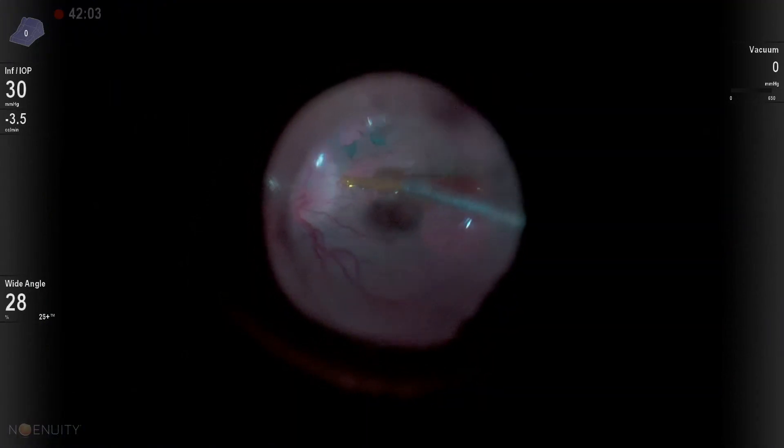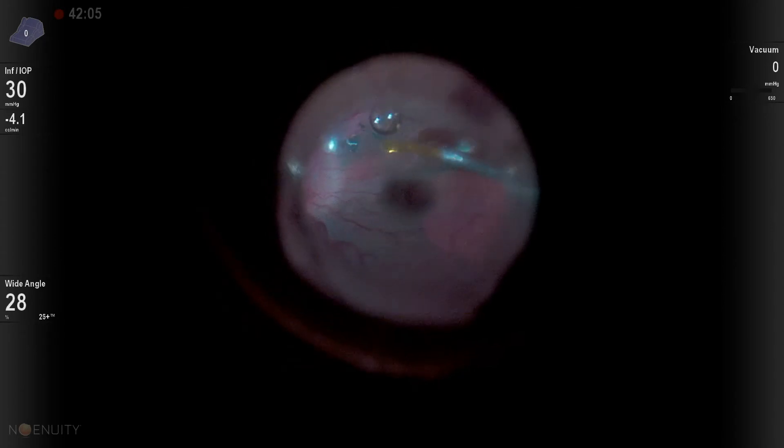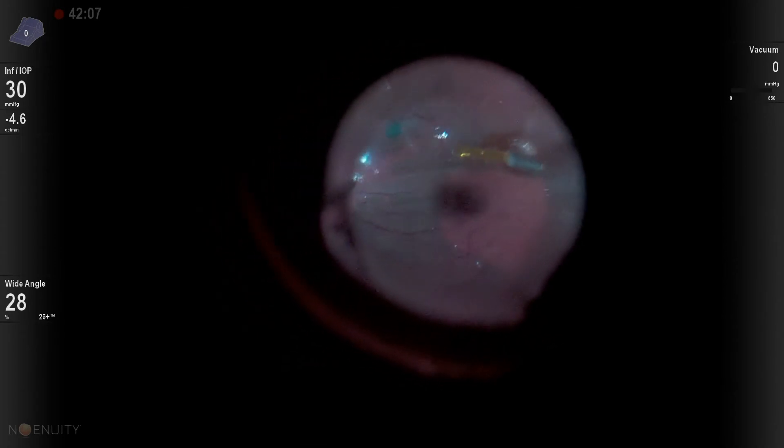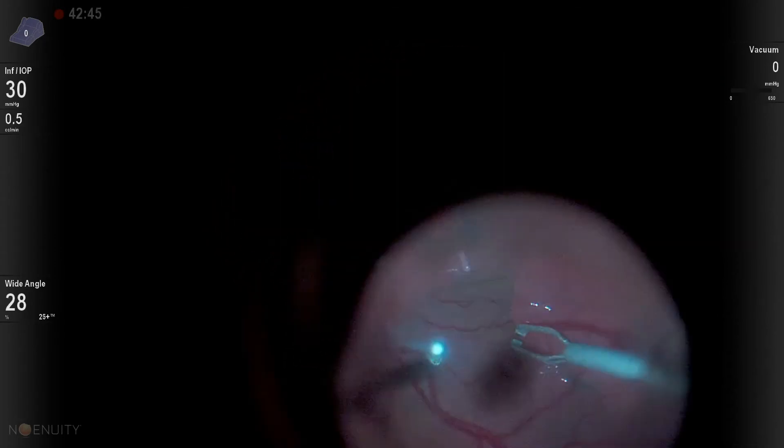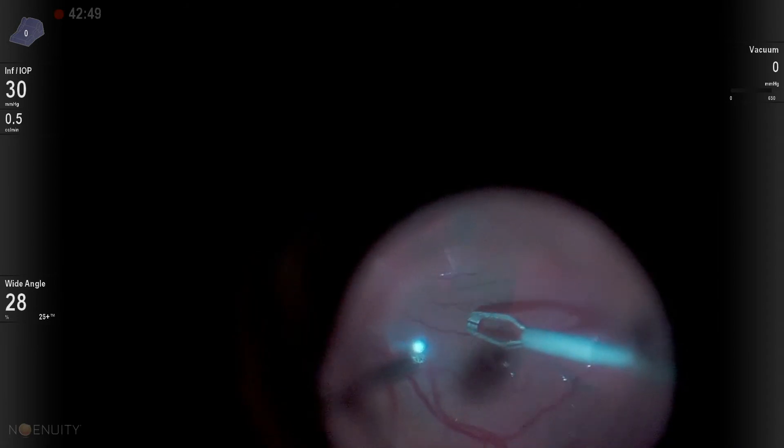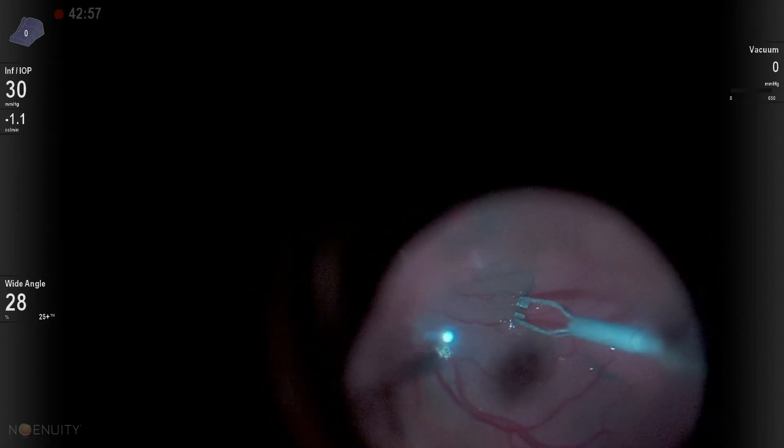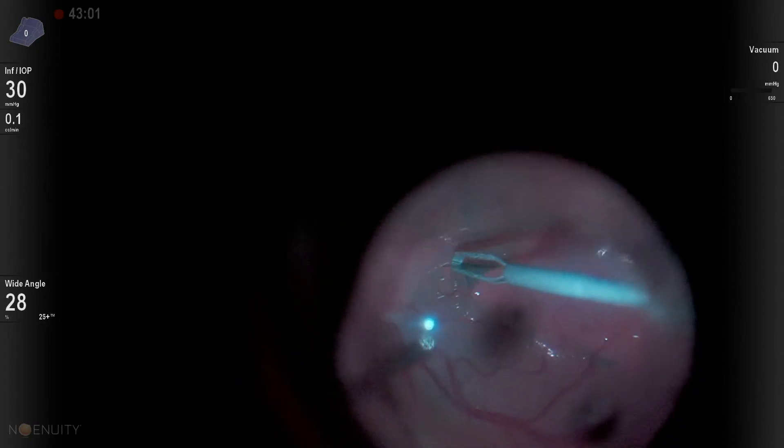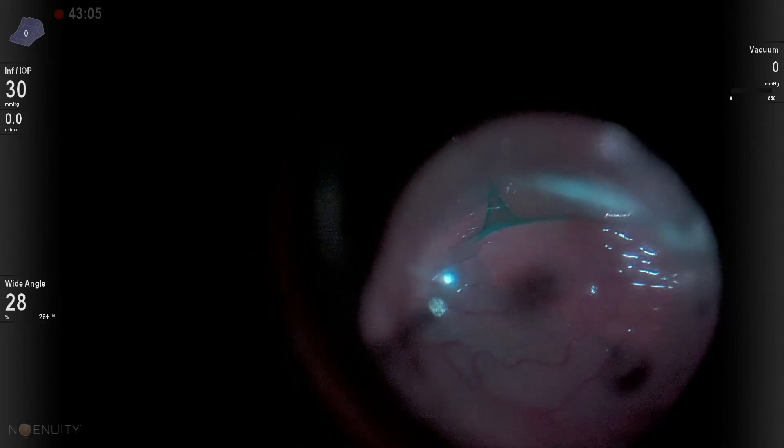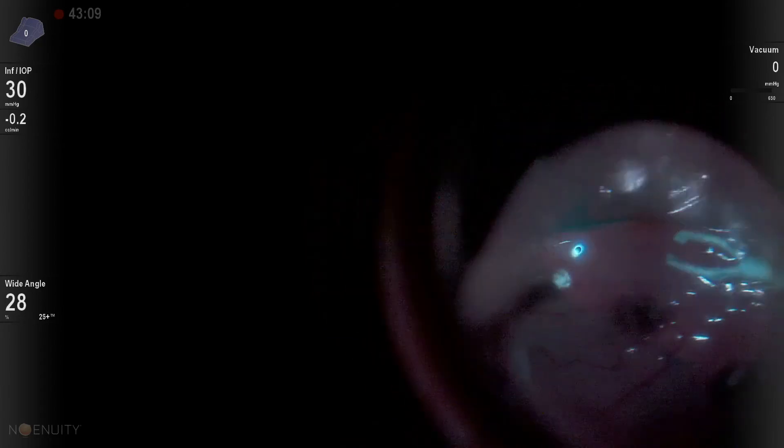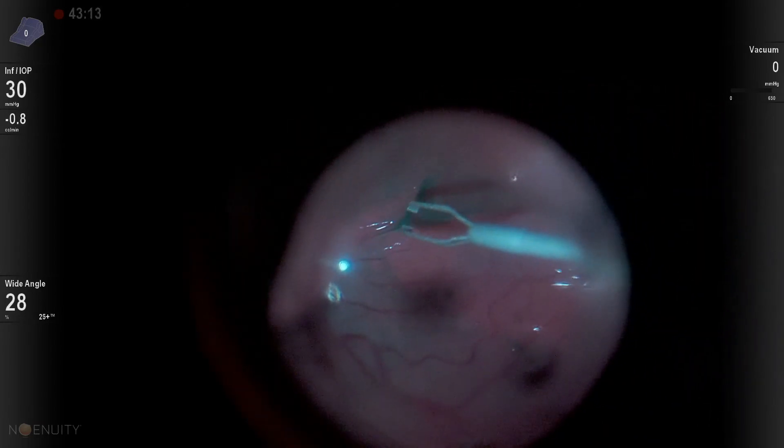I'm going to put in the PFO. And this will give me a really good, stable surface to finish my peeling. And I've found that I really do love peeling under PFO. The key to successful peeling under PFO is it's almost like a Rhexis where you fold the ILM back on top of itself.